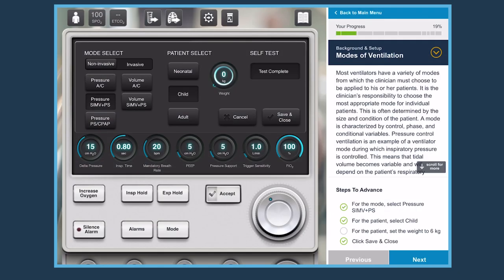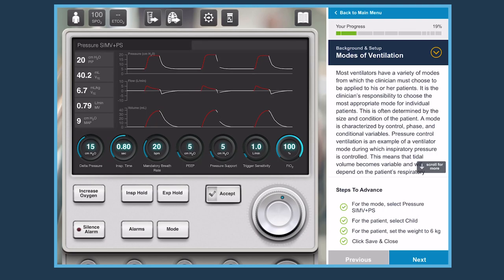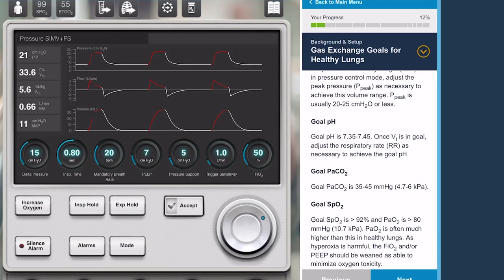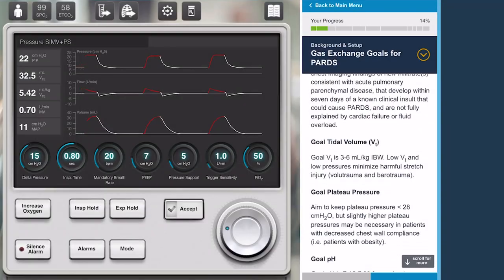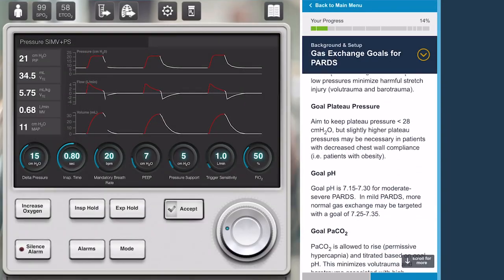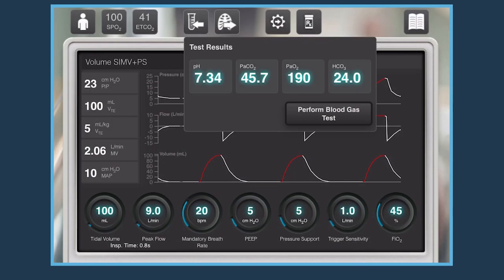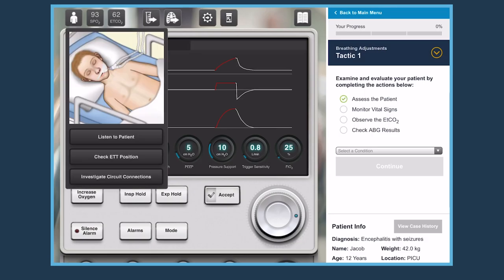By completing this simulator, the learner will be able to describe the key features of a mechanical ventilator, set appropriate ventilation and oxygenation goals for a variety of patient conditions, and demonstrate how to titrate ventilator parameters to achieve adequate oxygenation and ventilation.